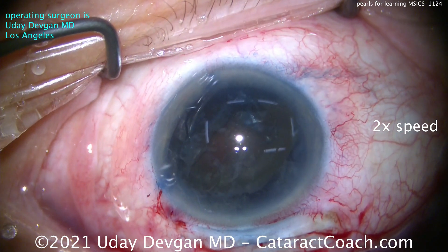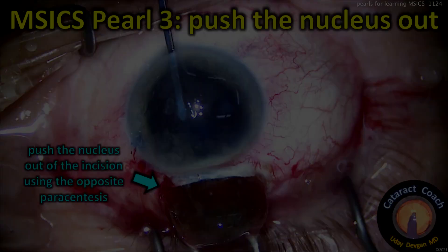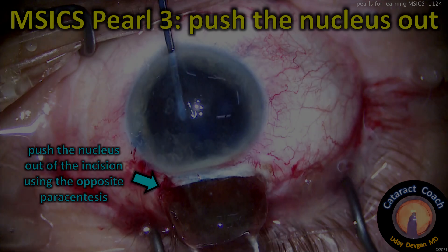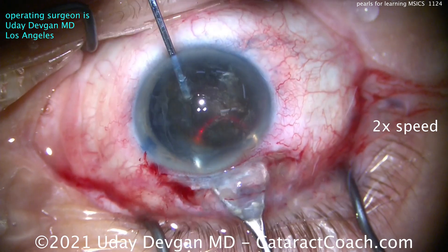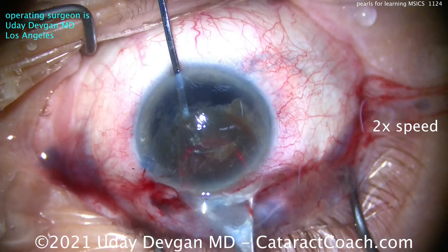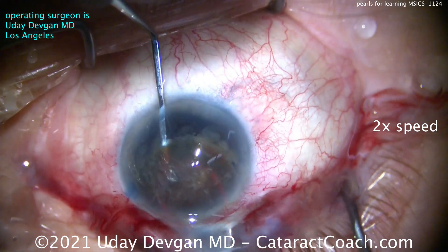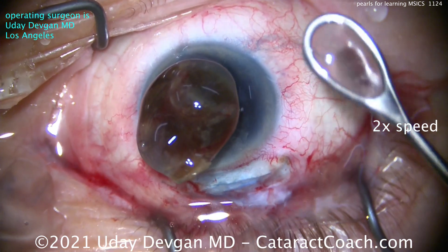It's going to be a tight fit to get the nucleus out, so here's the trick: inject more viscoelastic to pressurize the eye, then push the nucleus out. Using a spatula opposite the main incision to push — with the lens loop going under the nucleus — very important: do not let the cataract touch the corneal endothelium. Use the spatula in the left hand to push, push, push that nucleus. The pressure gradient from the viscoelastic helps, and boom — the whole nucleus comes out.